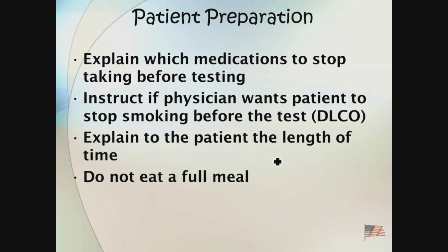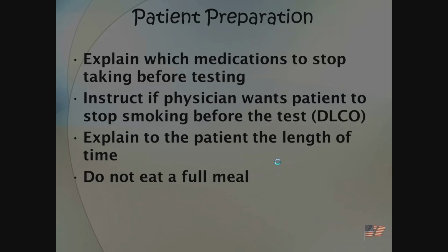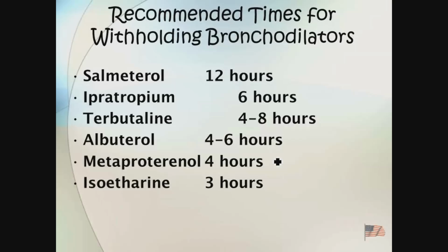As far as doing PFTs, we want to make sure, again, the patient has been notified to stop medications and to stop smoking. And this is usually done with whoever books the appointment: we tell them it's going to take an hour and a half or so, so block that amount of time out, and don't eat a full meal, because we're going to be nasty to you. I don't care that you know these times, but roughly we don't want them to have a dose of any kind of medication just prior to that.